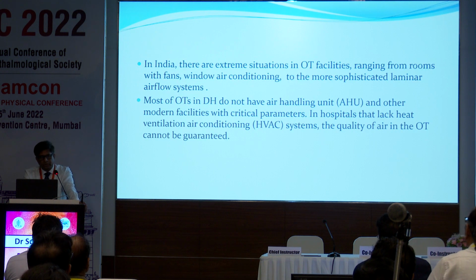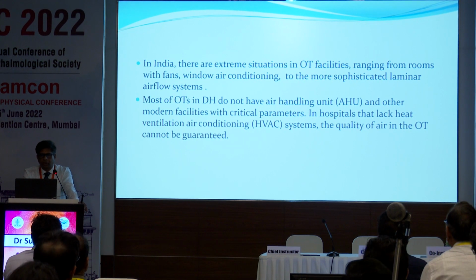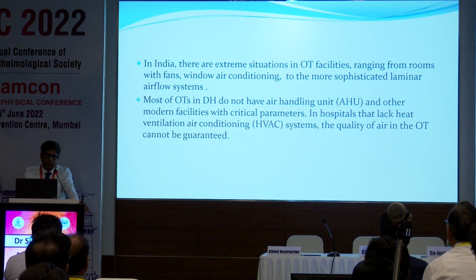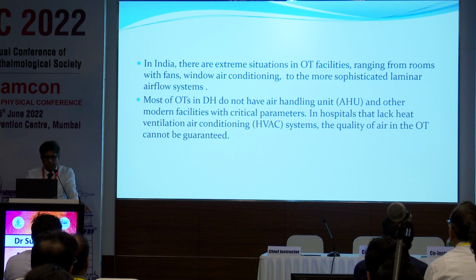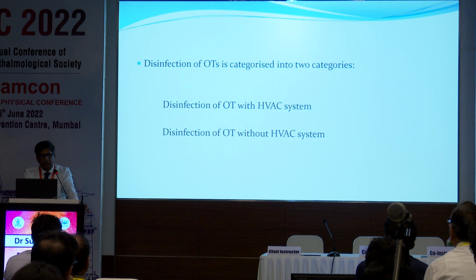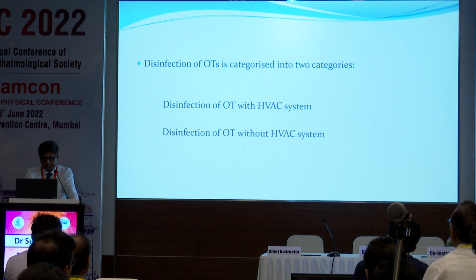Now coming to the fumigation. In India, as you all know, there are extreme variations in OT facilities, ranging from rooms with fans, then window air conditioning, and there are more sophisticated laminar airflow systems. As you all know, most district hospitals do not have the air handling unit or HVAC unit as Supriya has described, and in this situation, the quality of the air cannot be guaranteed. So we actually divide the OT disinfection into two categories: one, the OT with HVAC system, and the other, the OT without HVAC system.